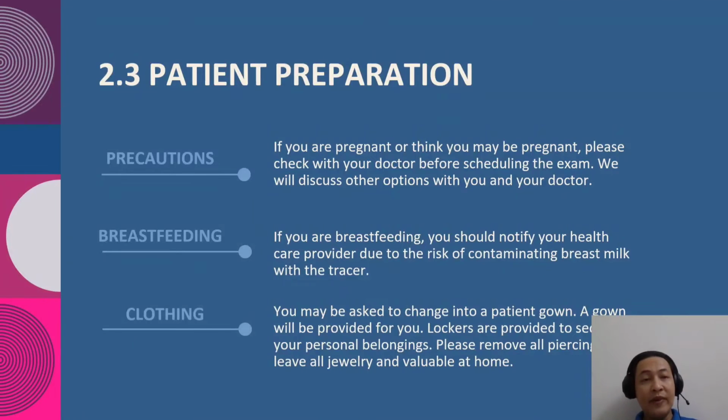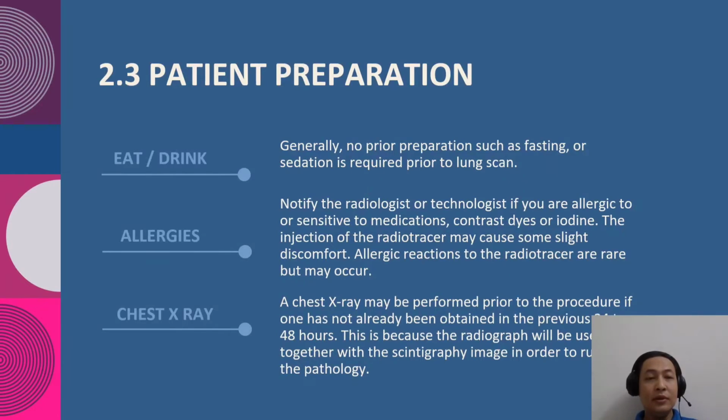For clothing, you may be asked to change into a patient gown. A gown will be provided for you, and lockers are provided to secure your personal belongings. Please remove all piercings and leave all jewelry and valuables at home. Generally, no prior preparation such as fasting or sedation is required prior to a lung scan.